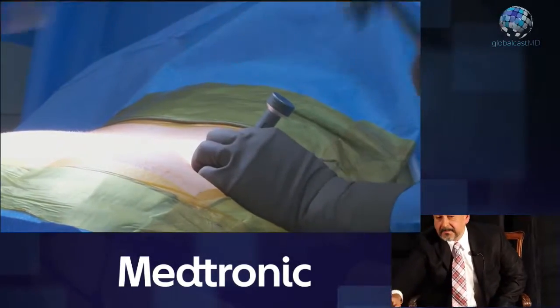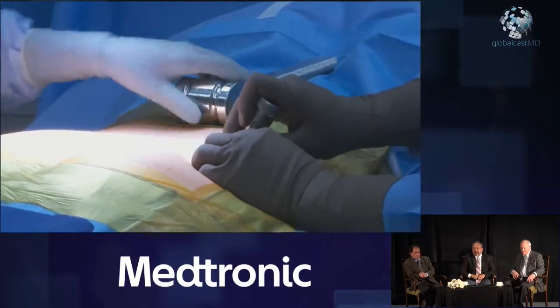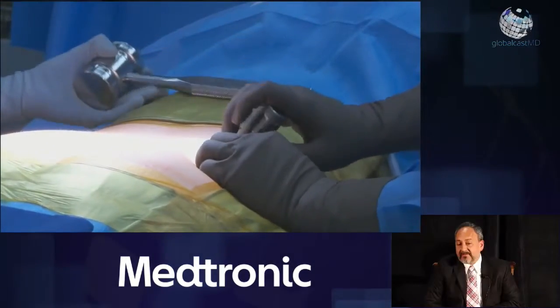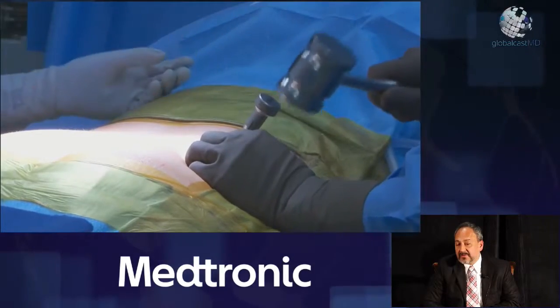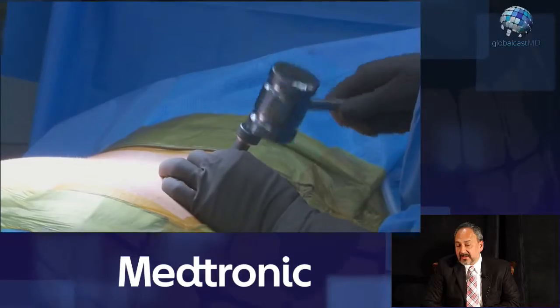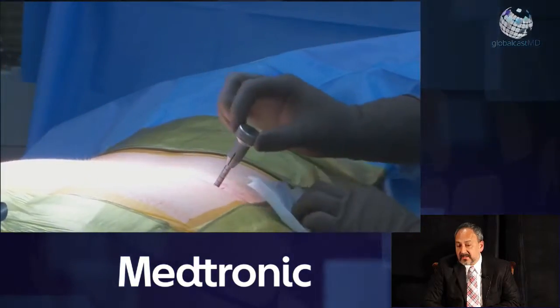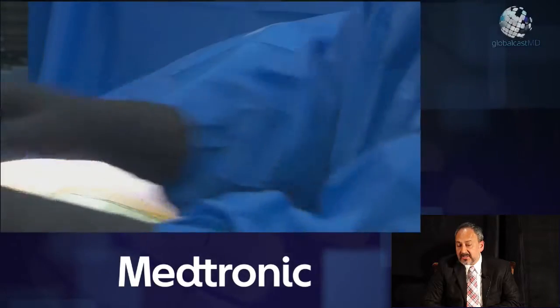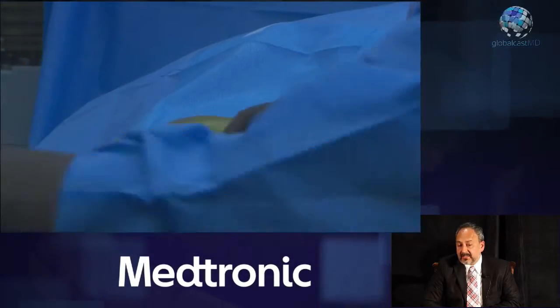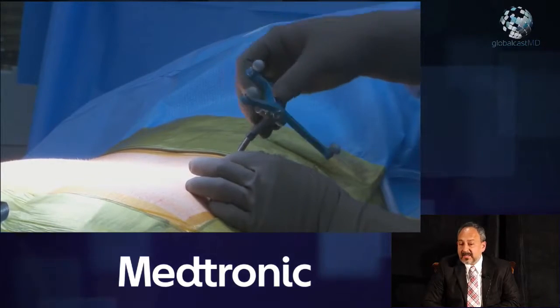You're doing this to place the PERC pin, right? Yes — this is the PERC pin to allow the reference frame to be placed for use with the O-arm navigation. This just goes about a centimeter deep into the cortex. We'll attach the reference frame to that and then do what we call the spin, which is the CT data acquisition.